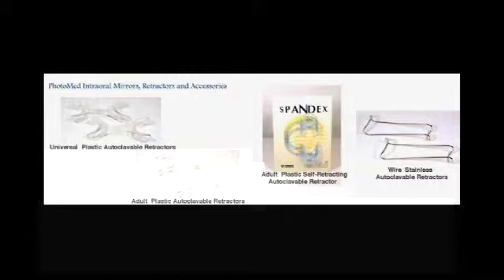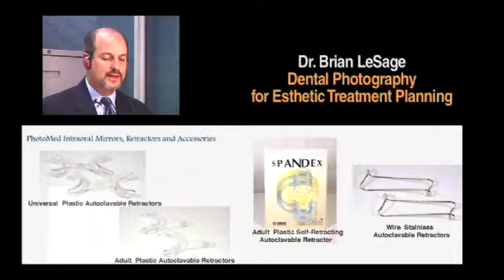These here, I would strongly not recommend using. These are maybe wonderful if you want to do some bonding or something, maybe for isolation and getting the lips away. But I find for photography, they don't quite spread the lips as far as we want them to, and these are not as nice here in the middle for photography.